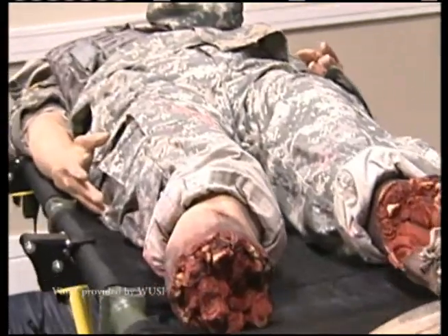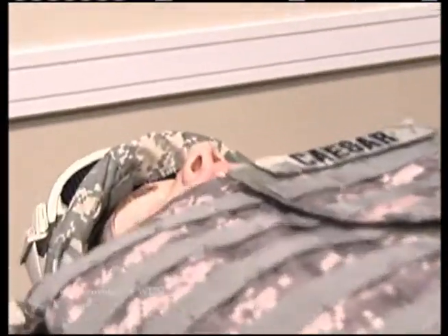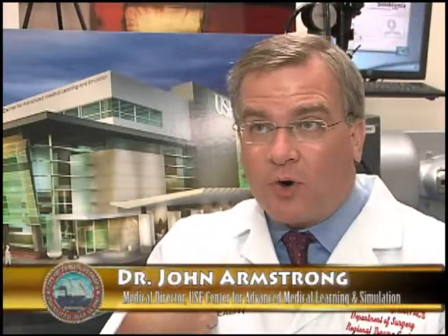The simulator, because the bleeding has been stopped appropriately, now wakes up. Same thing can be said for decompression of the chest successfully with a needle. That is the appropriate therapy, needle decompression for tension pneumothorax. When that happens, the simulator wakes up and says, I can breathe more easily now.